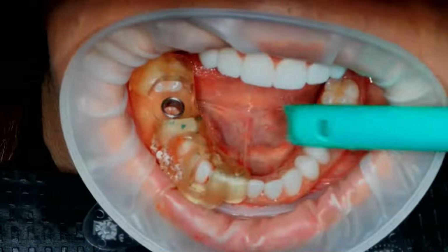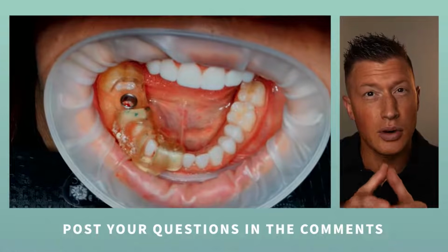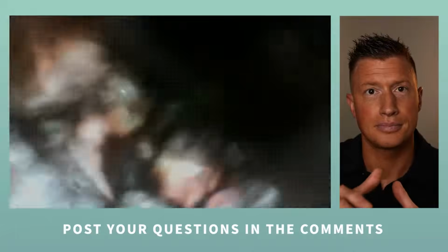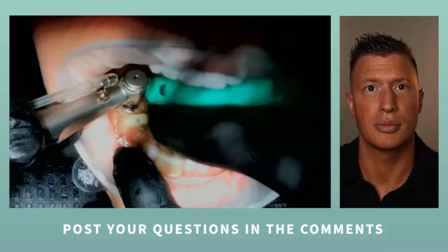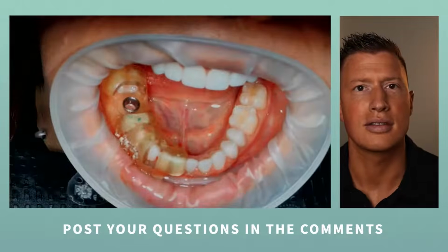But here I am using what's called a bone profiler. Sorry, am I leaning into the space there a little bit. That profiler helps make sure that the site where the implant crown is going to come off the implant is nice and flat. That's the first instrument I like to use. We don't want to have a irregular bone. We want to make sure it's nice and flush.